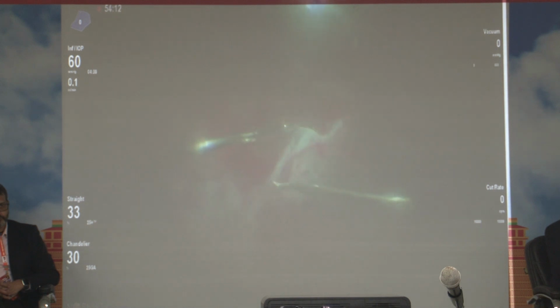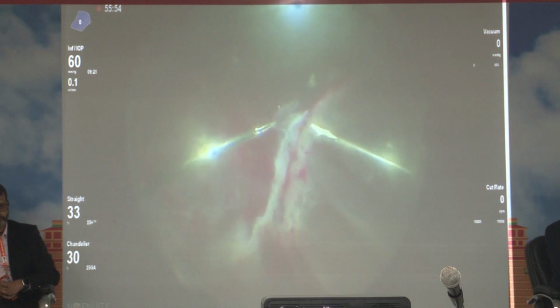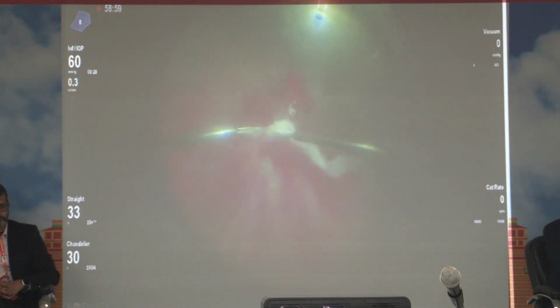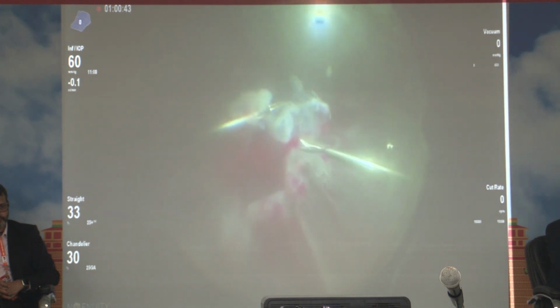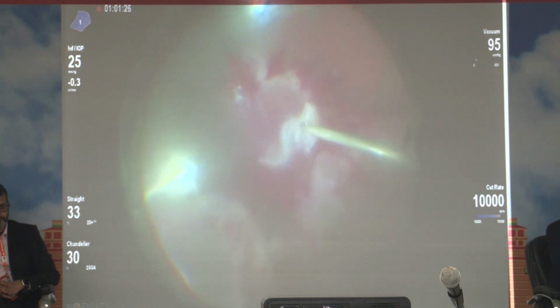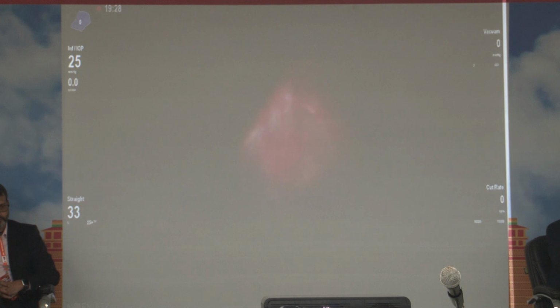Under that you have to adjust the gamma, hue, saturation, and most of these settings, and when you do it, you can see these membranes try to get a fluorescent kind of hue. That definitely helps us, especially when it is mixed with blood and a thin necrotic retina. So I just wanted to show how easily we can get through these bimanual membranes using the various filters. Especially here I am using the reduced red filter and the green filter. Again you can mix and match whatever best suits your hand.